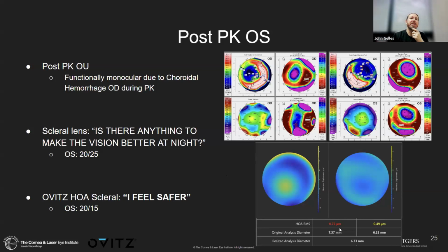And what you can see here is we got about a 40% reduction on this, but the patient improved by about 2 lines of visual acuity. And the response from this patient was so impactful. They told me, "I feel safer."